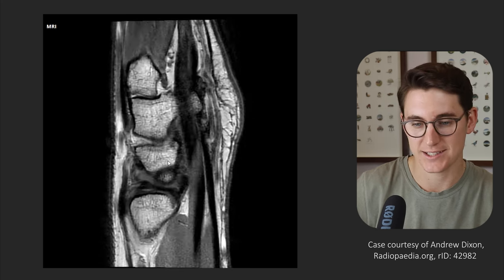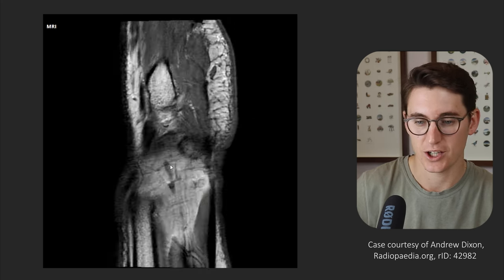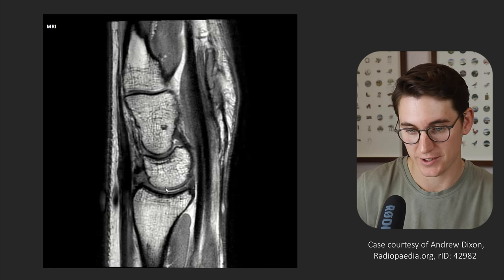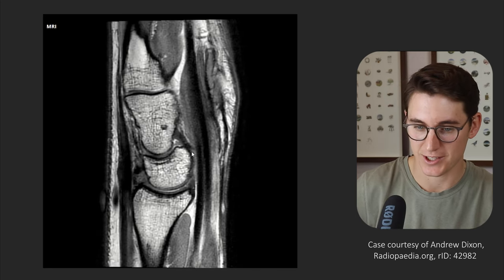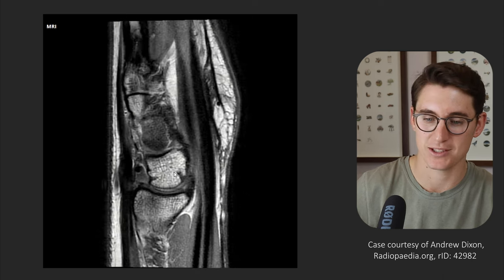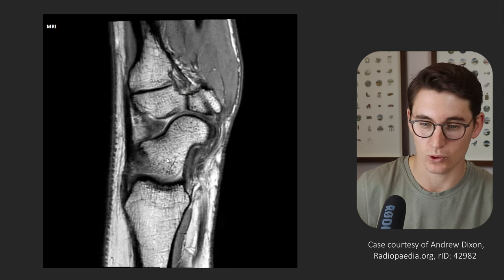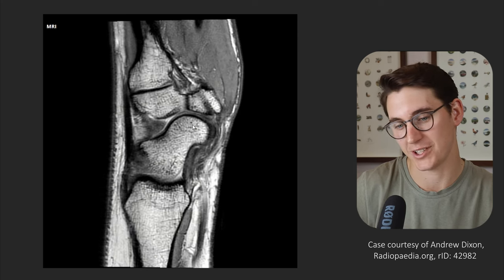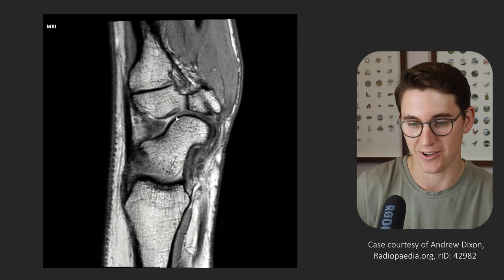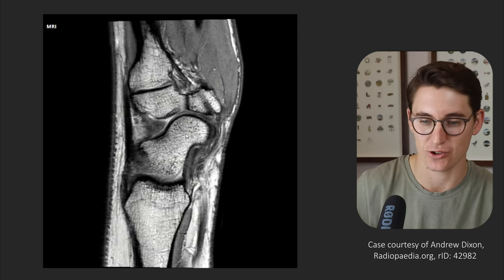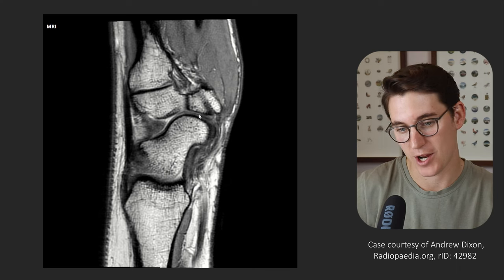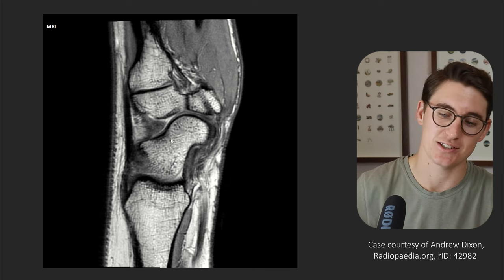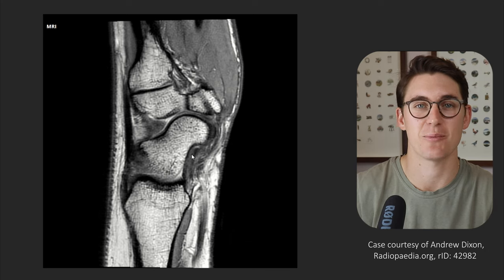We also have our STT joint. To find it on the axial slices, it's easiest to find the crescent-shaped lunate cupping the capitate, then head out towards the scaphoid which goes from posterior to anterior. Here is our STT joint — our scapho-trapezio-trapezoidal joint. There are intrinsic ligaments attaching these structures, though I won't detail them further on this MRI.